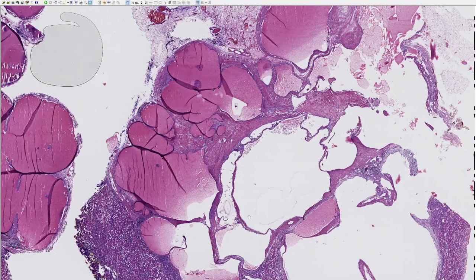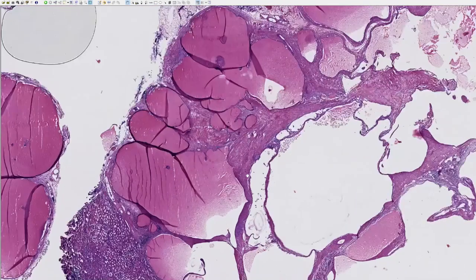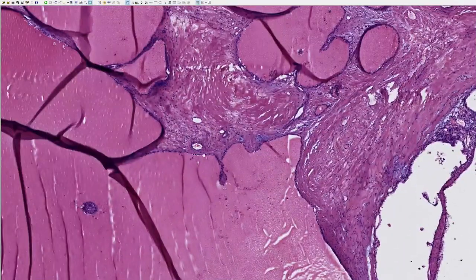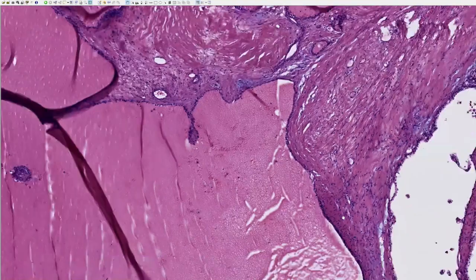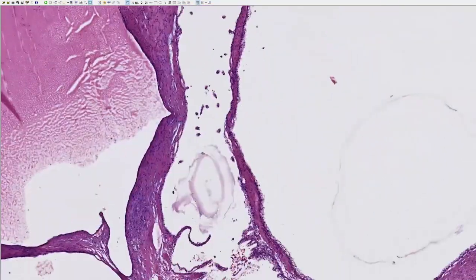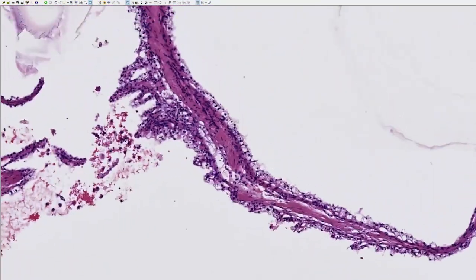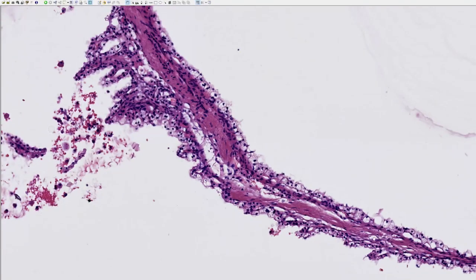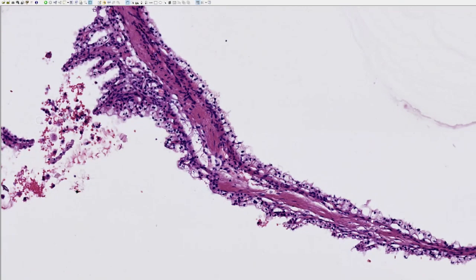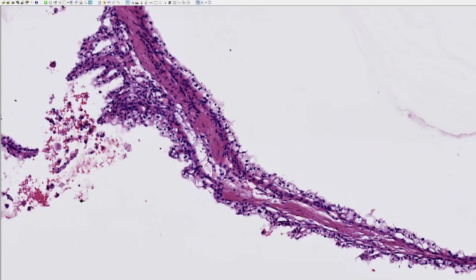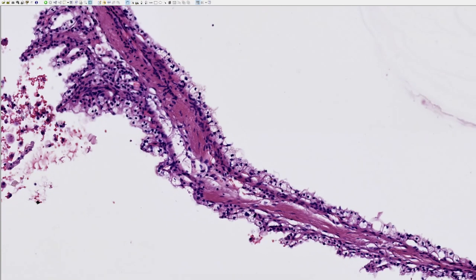Going closer to evaluate the cyst lining, which is mostly flattened and not well discernible, but in some areas it is better preserved. Here we can appreciate a single layer — admittedly with some focal, minimal tufting — of cuboidal cells with clear to somewhat vacuolated cytoplasm and low-grade nuclei that are, very importantly, haphazardly arranged within the cell cytoplasm.